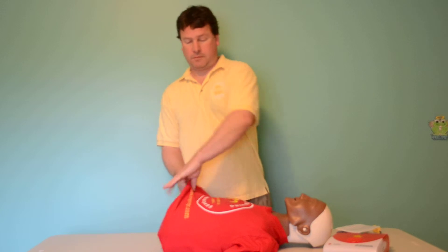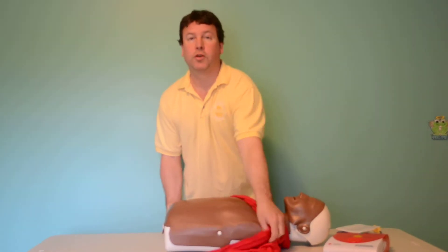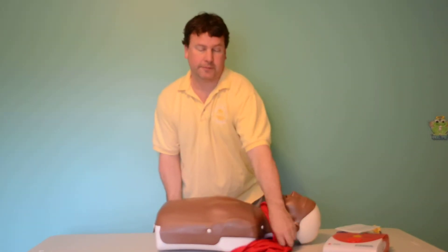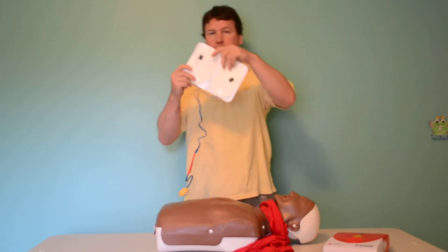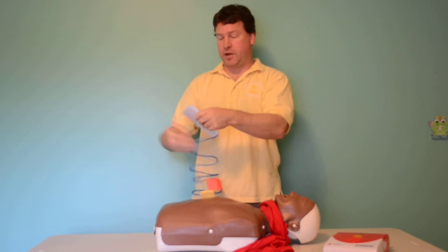Remove the clothing from the person's chest. Attach the pads firmly to the person's chest as shown.